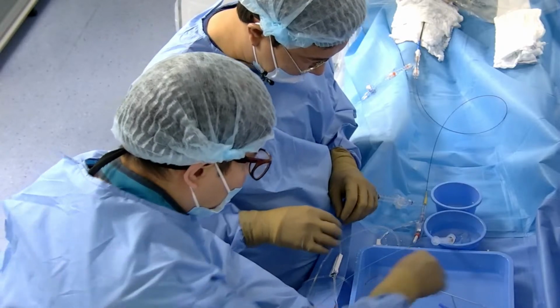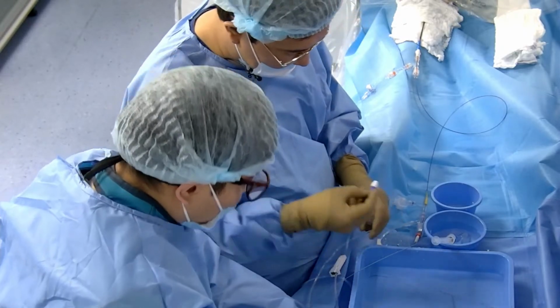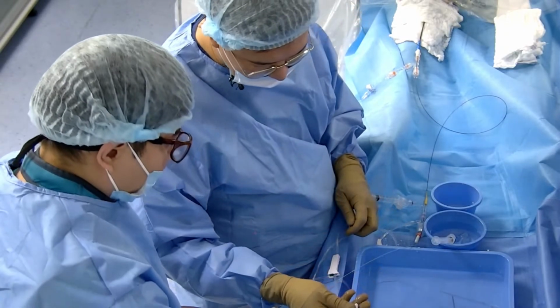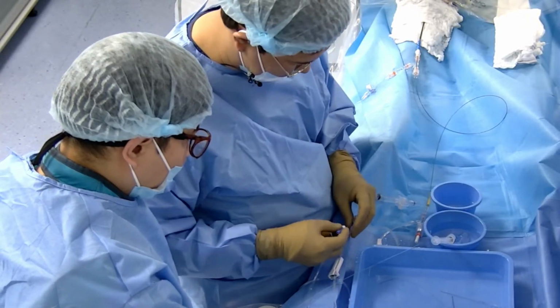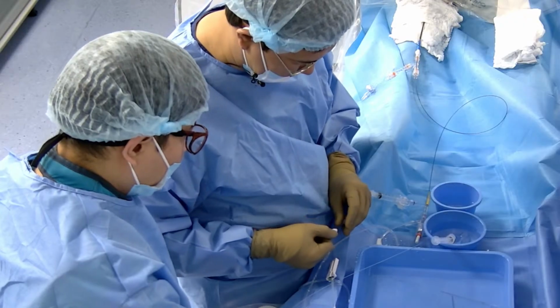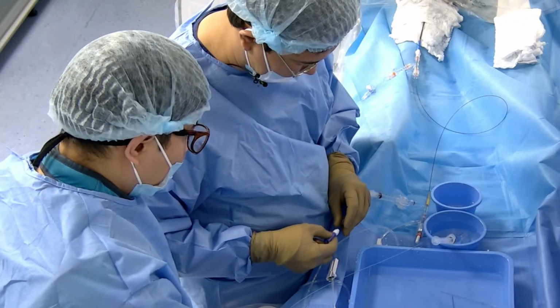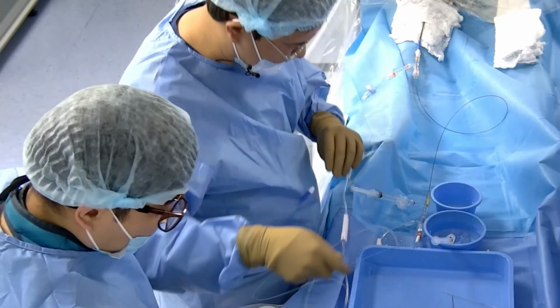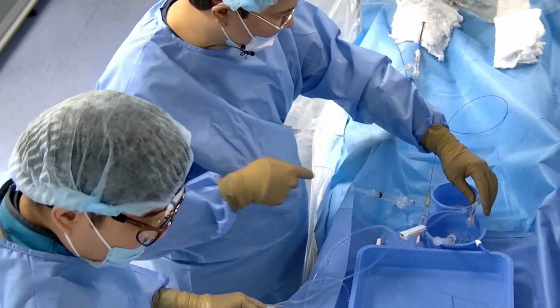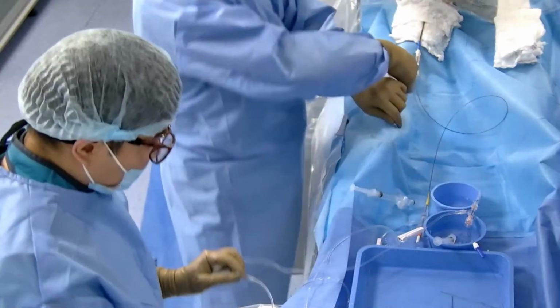With this wire, let's see how it would be. The torque is blue. This is for identification. Okay, let's see. It looks like it's rotating, but it's very important to see how long it will keep the angulation.